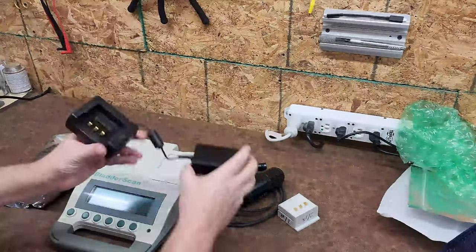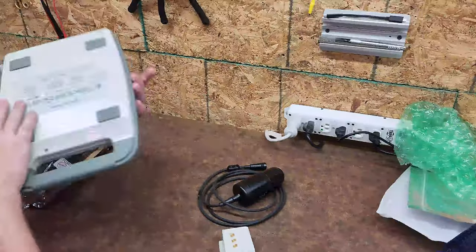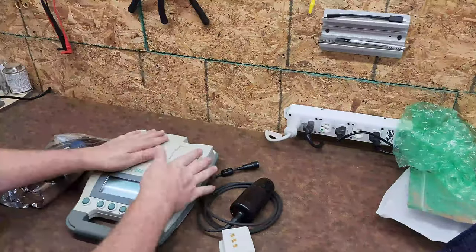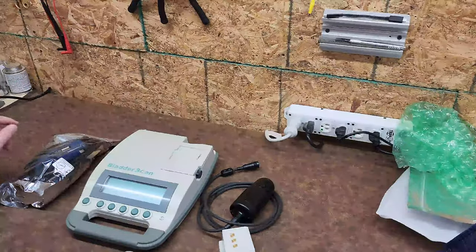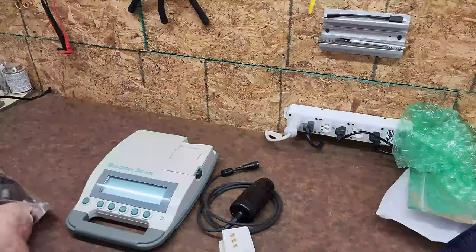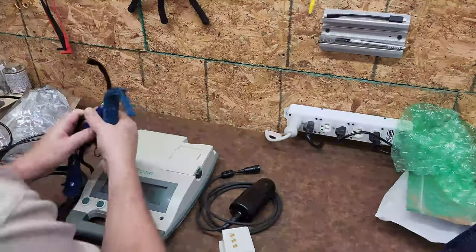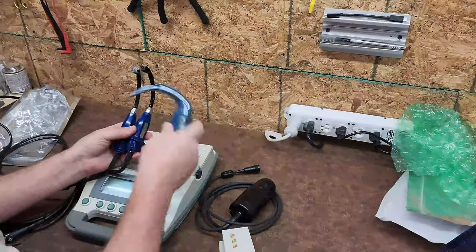I have the battery charger, one battery, and the probe. The probe does have some visible damage and the bladder scanner has some visible damage too, but I bet I can still get them up and running. That's very cool.